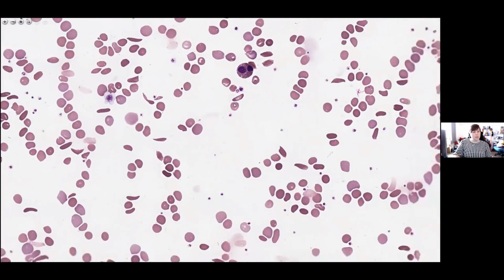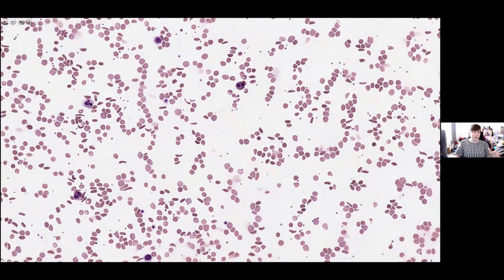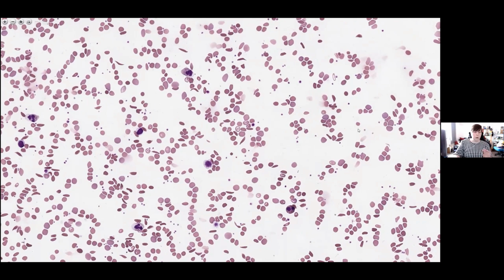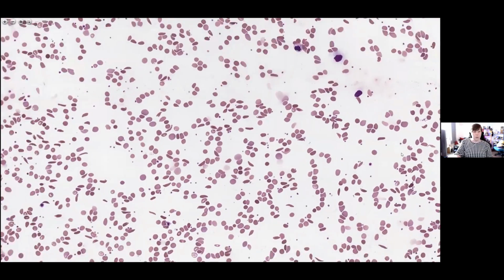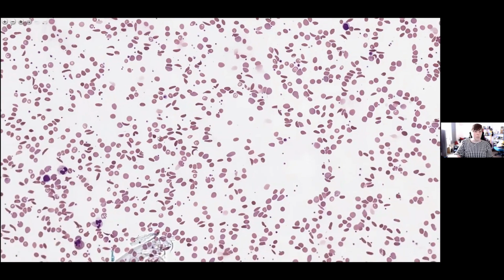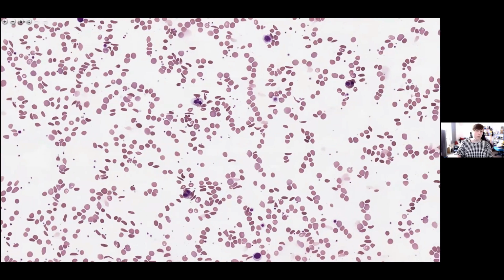And so all that put together to me says a sickle cell disease in a patient with probably acute chest syndrome. And if you work somewhere in the world where sickle cell disease is quite prevalent and endemic, you will see these a lot. I know in my hospital, we see many of these patients because they are part of our local community. But if you live somewhere, perhaps where I used to live in Australia, you might not see these as often, but they are actually quite prevalent in some parts of the world. So I think that's what we have so far on this film.